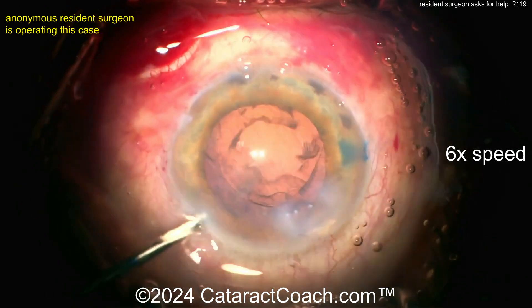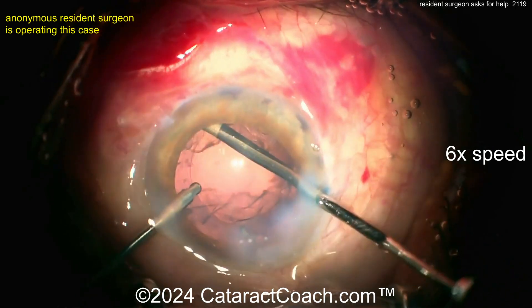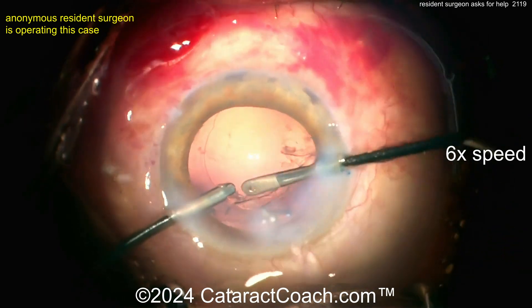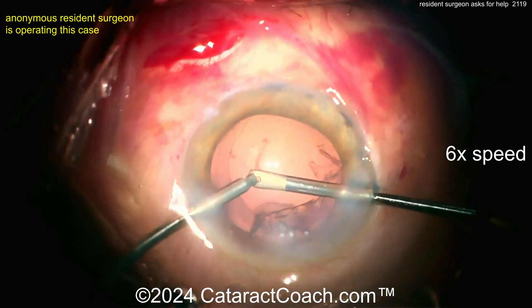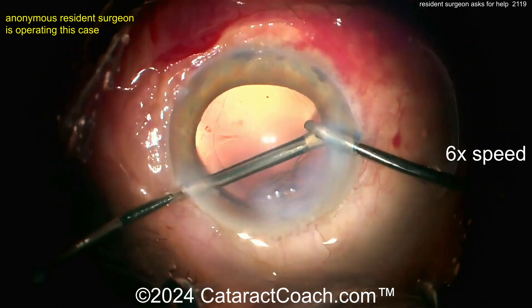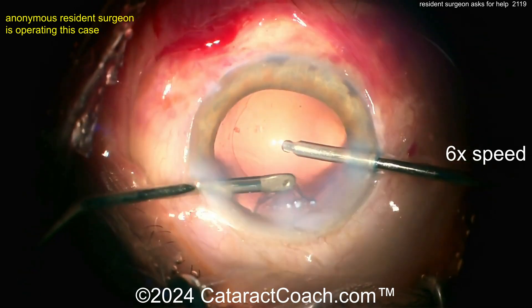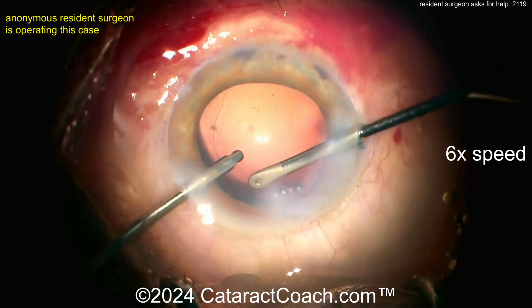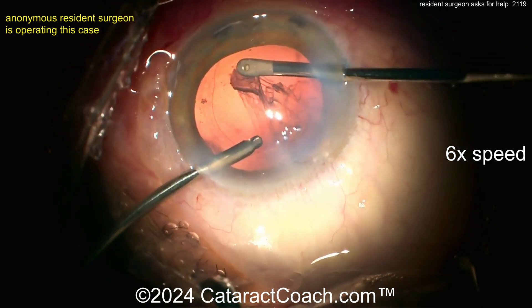For 20 cases in, you have reasonable hands, but you just don't have the basics down. The basics are what you need. Get the eye in primary, keep it centered up. I think you're doing a good job for where you are, but I think you need to change gears completely. You need to be a lot tougher on yourself — don't be so content with what you're doing. Focus on pivoting in the incision, keeping the eye in primary, keeping it in focus. These are the skills I want you to work on most, and that will give you the best bang for your buck.